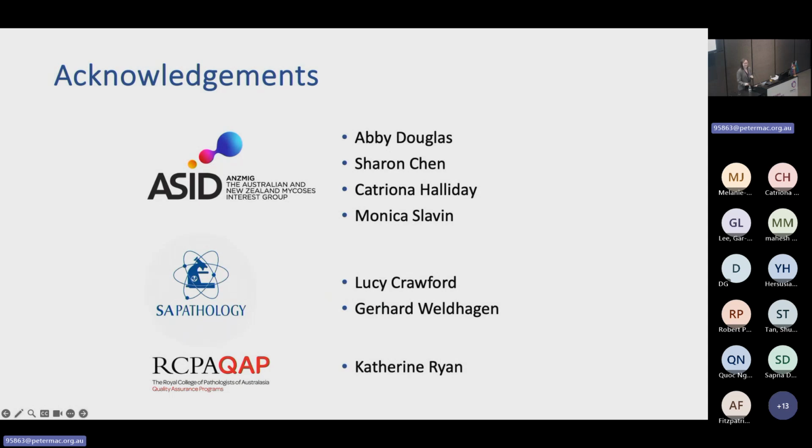Sarah, we brought up the fact about doing AST by Sensititre, and Sarah's slide shows that 12 out of something labs use Vitek. So can we open the discussion about whether the labs using Vitek could send the isolates on for Sensititre, and how does that affect the governance, and how does it affect what everyone thinks?